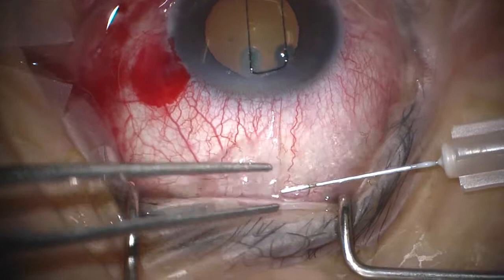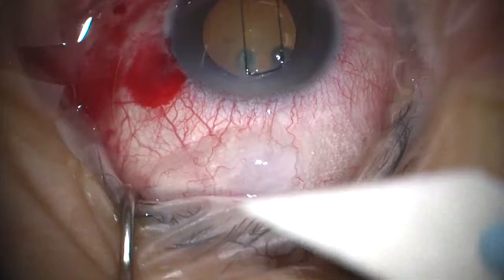So we just, mitomycin, please. So we're just about to start this case. She's a 61-year-old lady with advanced glaucoma. She's got good vision, but advanced field loss. And the pressure is about 27.